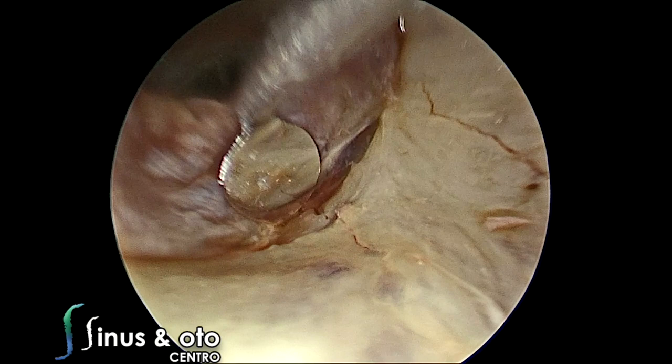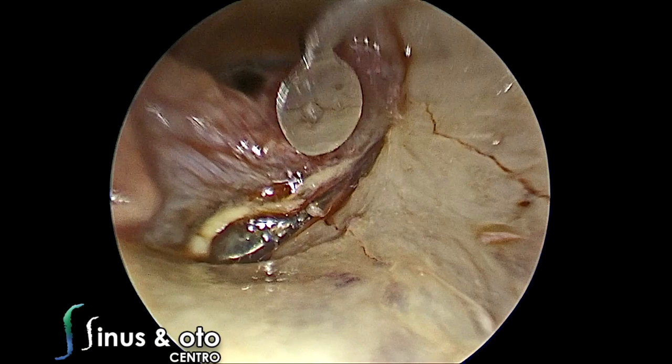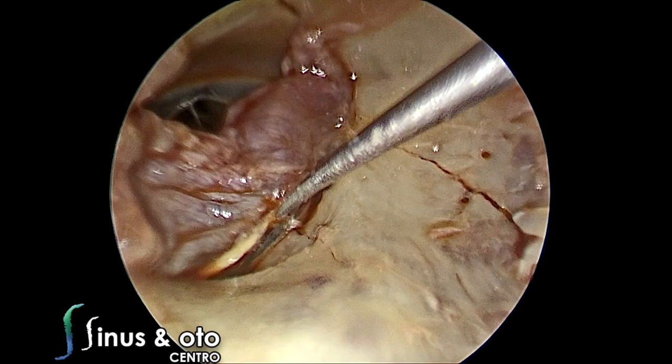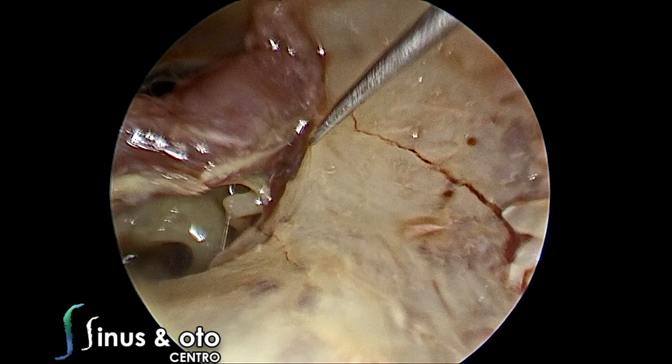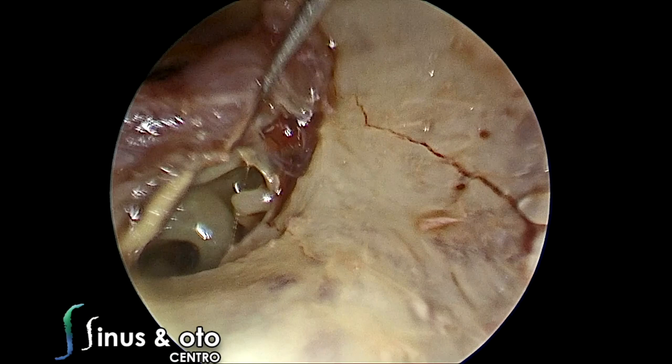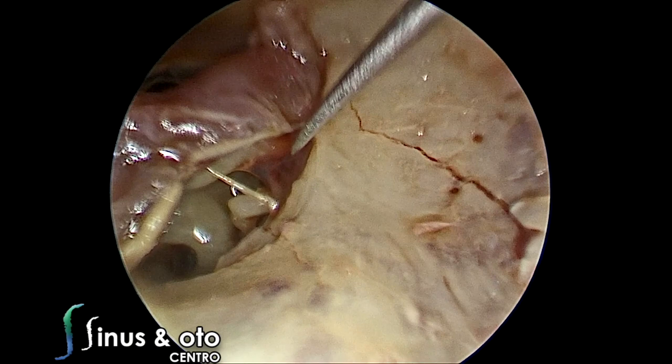Nowadays, there are instruments that allow suction with elevation. A suction elevator can be used, but if you use a combination of good hemostasis, good anesthesia, and adrenaline-soaked cottonoids, you probably won't need those suction instruments. We elevate the annulus along with the tympanic membrane and expose the posterior malleolar crest, which is the home of the posterior malleolar ligament — which is this one that we are cutting.